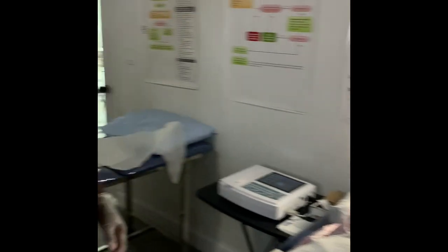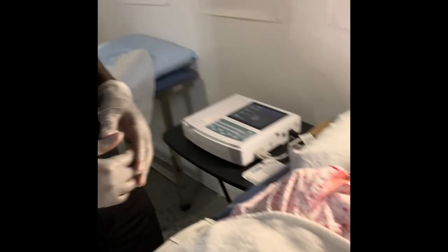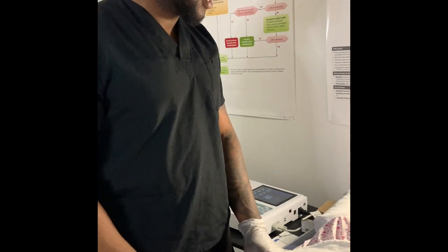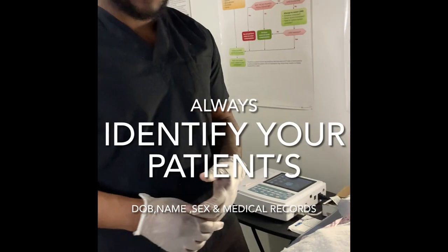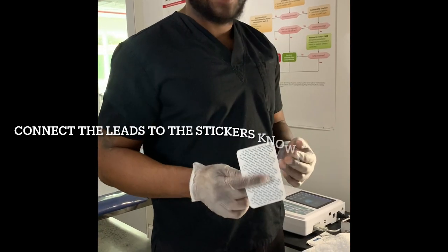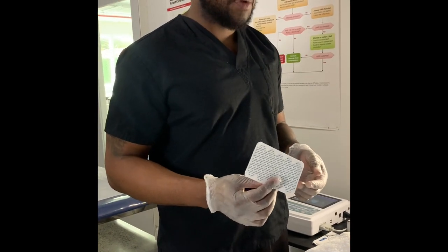This is my patient right here. Whenever you walk into a room, you always want to identify who you are and let the patient know what you're going to be doing. My name is EKG technician Sam, and today I'll be performing an EKG — is that okay with you? Once the patient confirms and says it's okay, you proceed. If the patient says no, then do not do the EKG. You want to let the patient know you're going to place electrodes on their skin, so they'll need to expose themselves so you can perform the EKG properly.